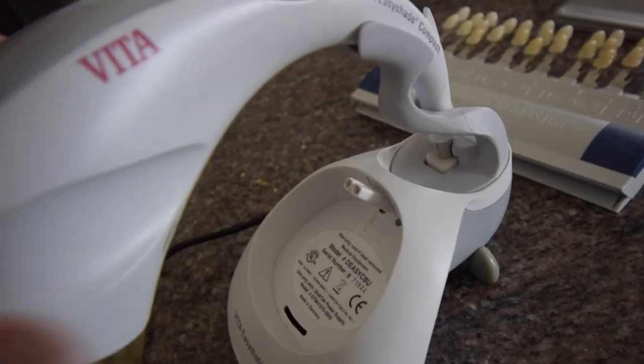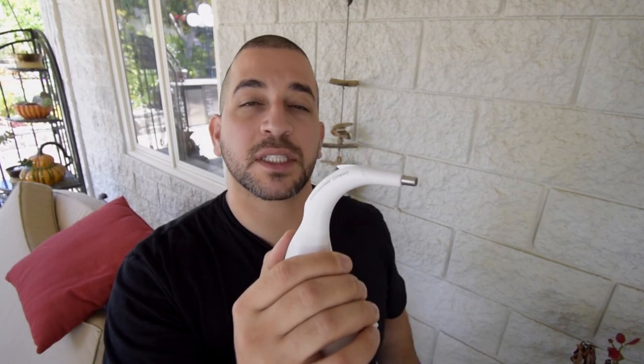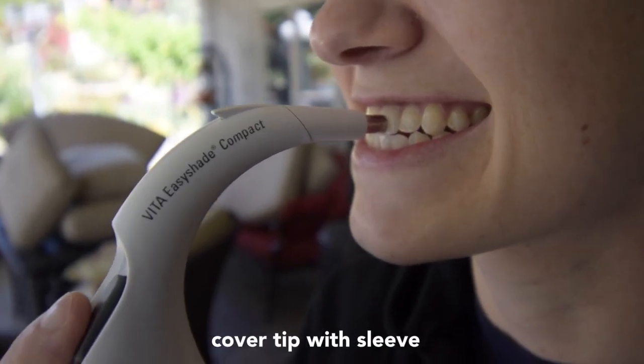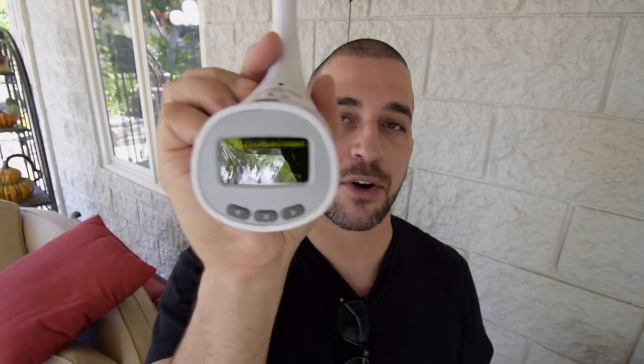The first thing you do is calibrate the device. After calibration, you place the tip of the device flush to the surface of the tooth that you're selecting the shade for. You click this button, it will give you a few beeps, and then it will give you the shade on this little monitor towards the back. It can give you the shade from the Classical Shade Guide System and also from the 3D Shade Master System.